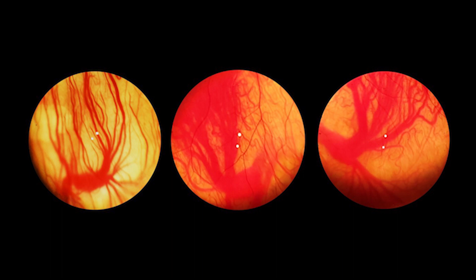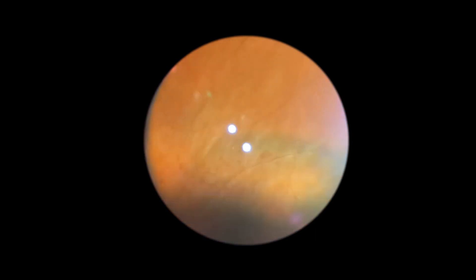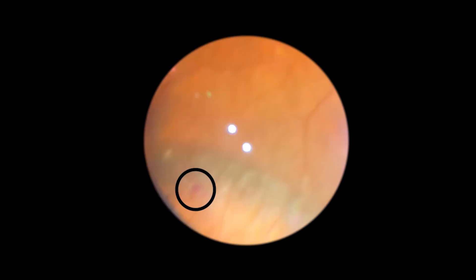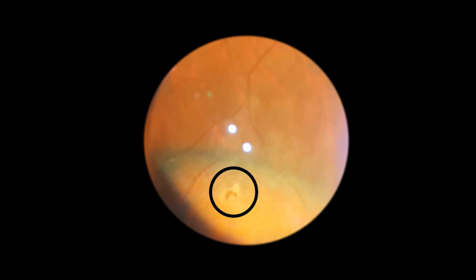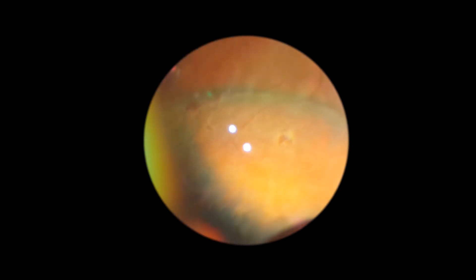Here you see the different configurations of a vortex vein in an albinotic fundus. In the next patient evaluated prior to cataract surgery, a horseshoe tear was detected with a hemorrhage close to it. As you can see, when you palpate the retina with the scleral depressor — moving from side to side and up and down — the character of the hemorrhage doesn't change. But when you look at the horseshoe tear, you can see the tear opening up, the flap coming forward, and the operculum moving as you do scleral depression in a dynamic fashion.